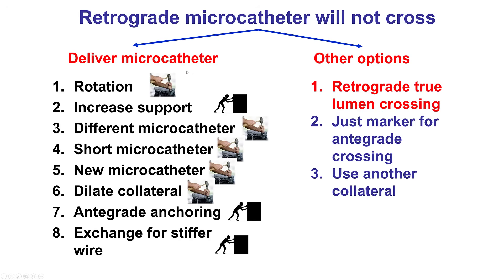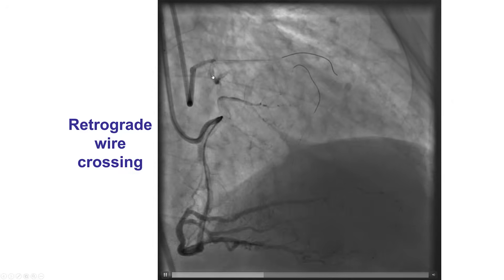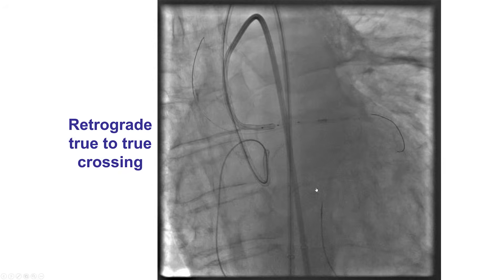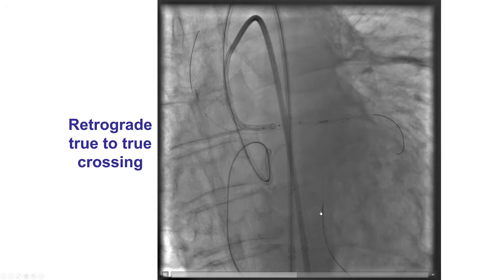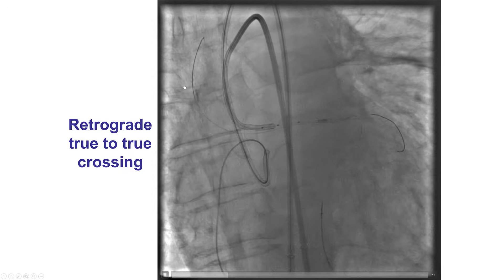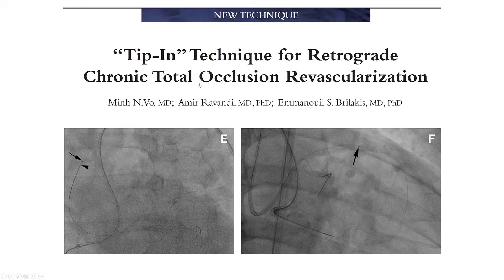Sometimes this fails and the microcatheter cannot be delivered. The first alternative option is to attempt retrograde crossing from true to true. This is an example of an LAD CTO with retrograde advancement of a wire from the right coronary artery. Unable to advance the retrograde microcatheter all the way to the LAD; however, the occlusion was short and the retrograde guide wire was successfully advanced into the proximal true lumen and out into the aorta. The guide wire was snared, and the procedure was successfully completed.